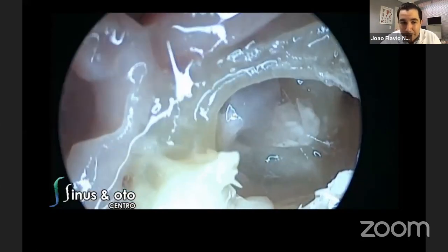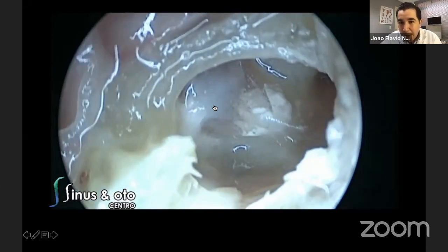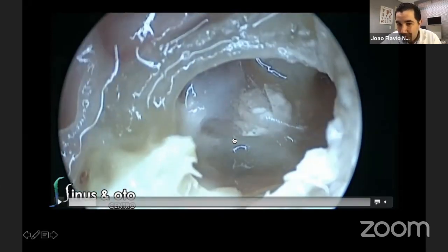And then we can see here the saccule, the vestibule. Here is the elliptical recess, the spherical recess, vestibular crest here. As you can see, we can already see a nerve here, probably the superior vestibular nerve here, attaching to the elliptical recess, spherical recess, and the opening here of the posterior semicircular canal.